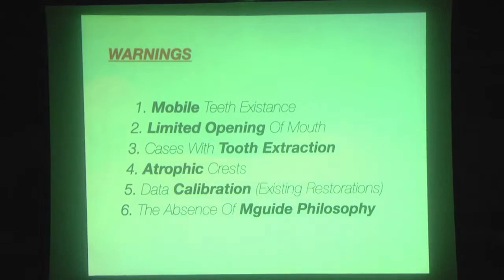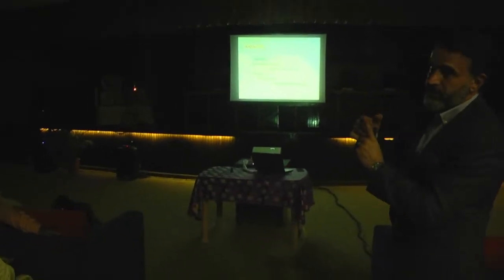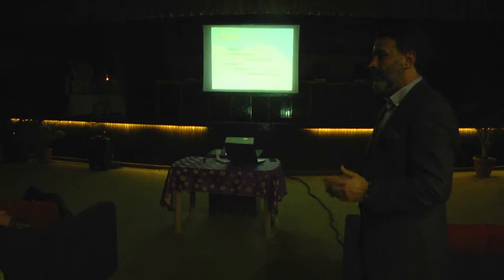Okay? And in the stone model, you see the tooth not in this position, you see it in this position. Then it is a very bad thing to finalize the M-guide system, and you cannot feel the right place to place the implant.